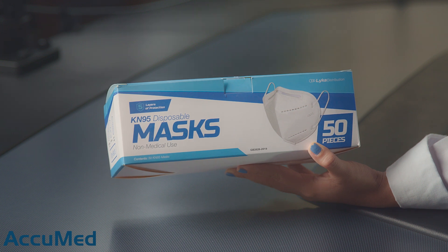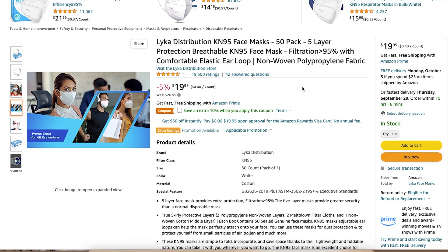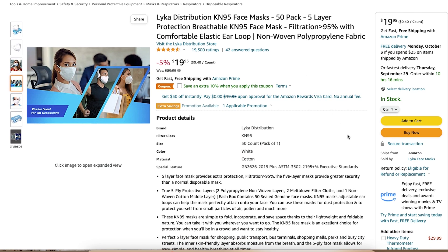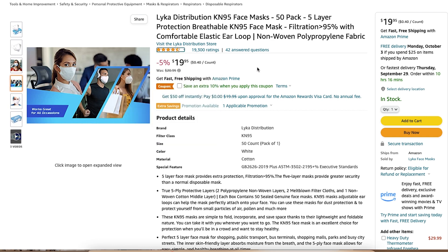Hello everyone and welcome back to the AccuMed channel. Today we're going to be reviewing the Lyka Distribution KN95 face mask. We purchased these from Amazon. These KN95s are made in China and they are a non-medical 5-layer face mask. They come in a box of 50 for $19.95. The listing also has a 4.5 out of 5 rating with over 19,000 reviews, so these seem to be very popular on Amazon.